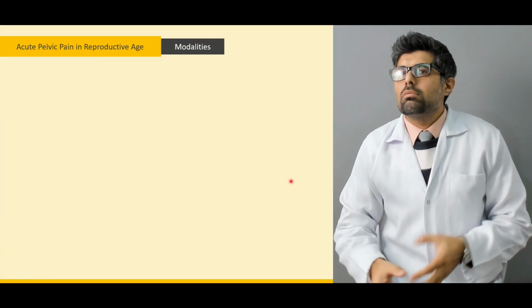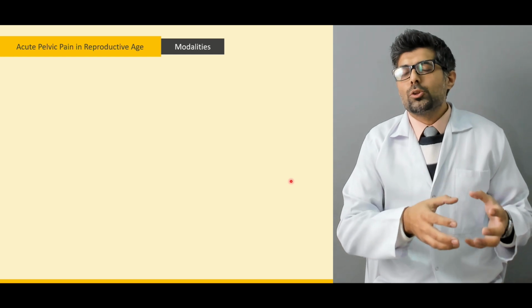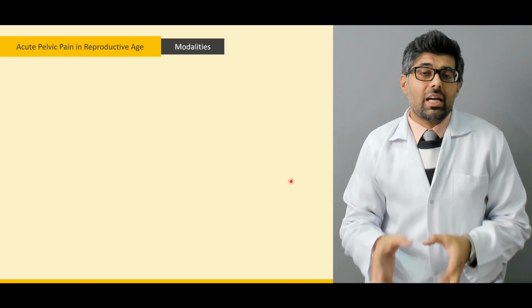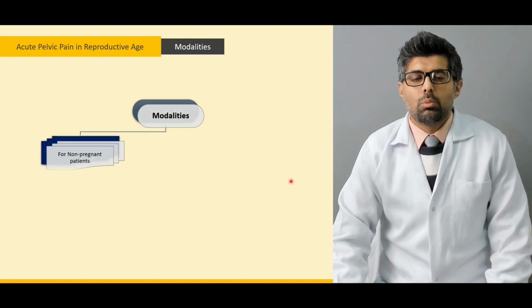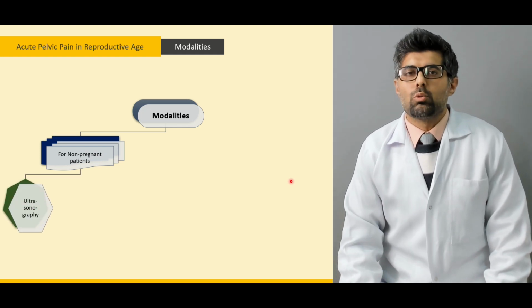Our choice of modality changes depending on whether the patient is pregnant or not. The modality for the non-pregnant patients is the ultrasound.